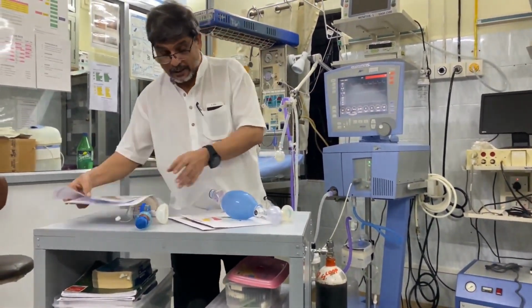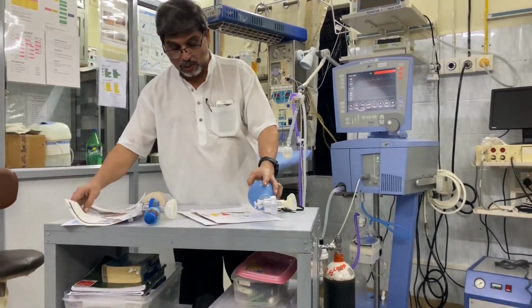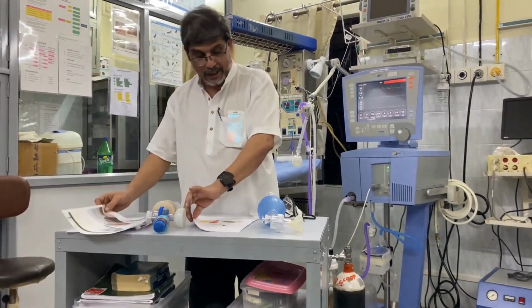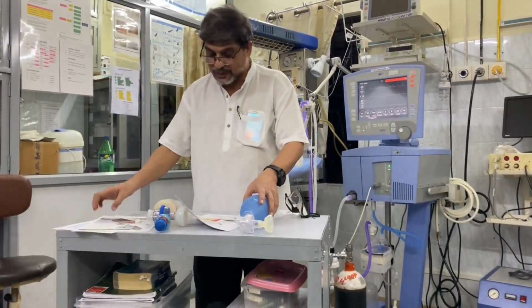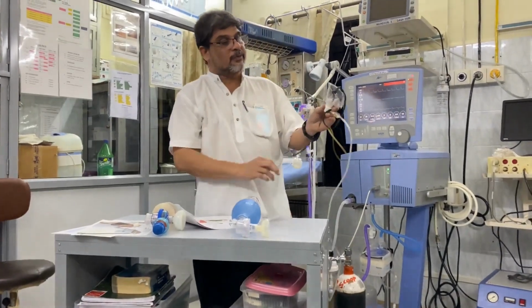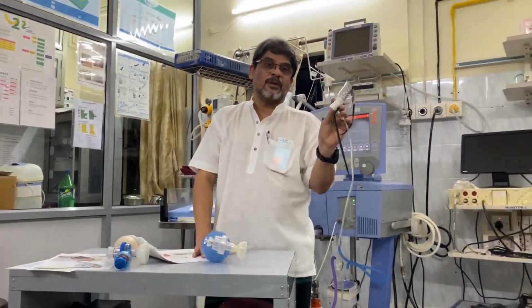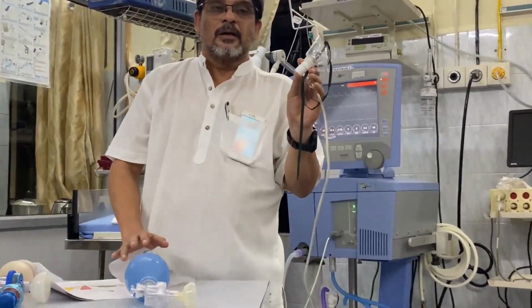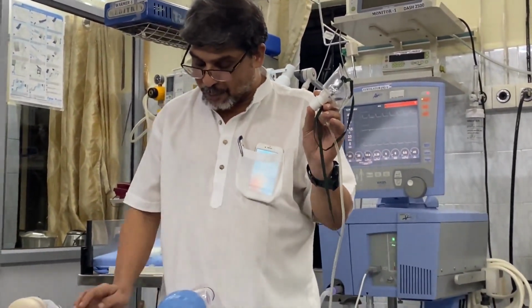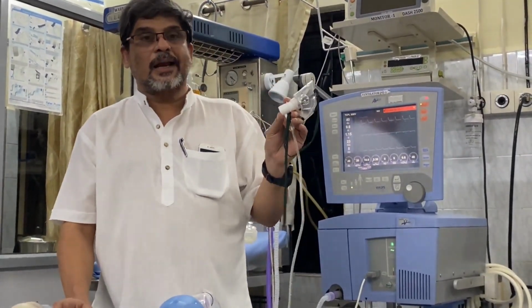Now if your patient is not maintaining oxygen on room air and he is a COVID patient and you want to give him supplemental oxygen, what are the methods which we have with us? The first method we use is free flow oxygen by mask. The amount of oxygen which we are supposed to give by free flow oxygen by mask is 6 to 10 liters per minute.